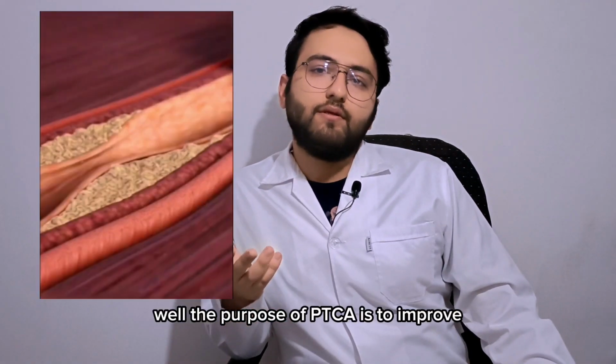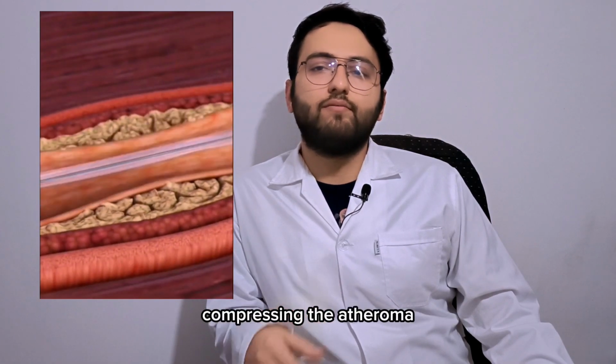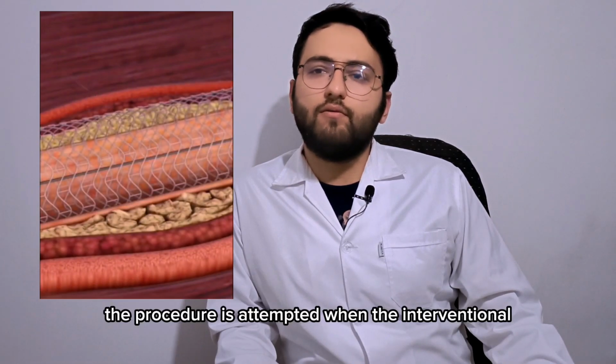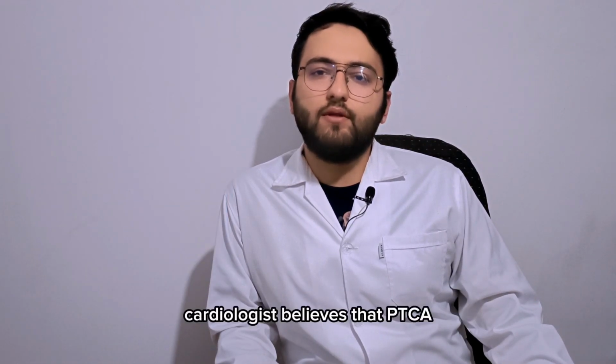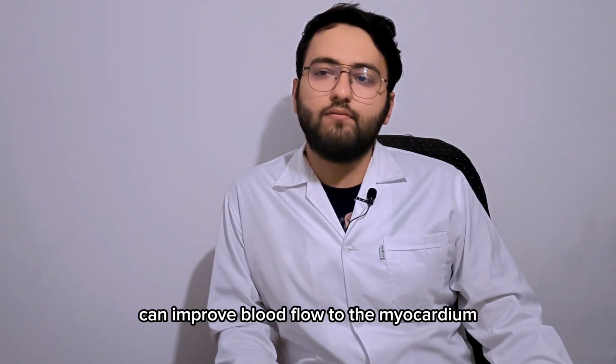Well, the purpose of PTCA is to improve blood flow within a coronary artery by compressing the atheroma. The procedure is attempted when the interventional cardiologist believes that PTCA can improve blood flow to the myocardium.